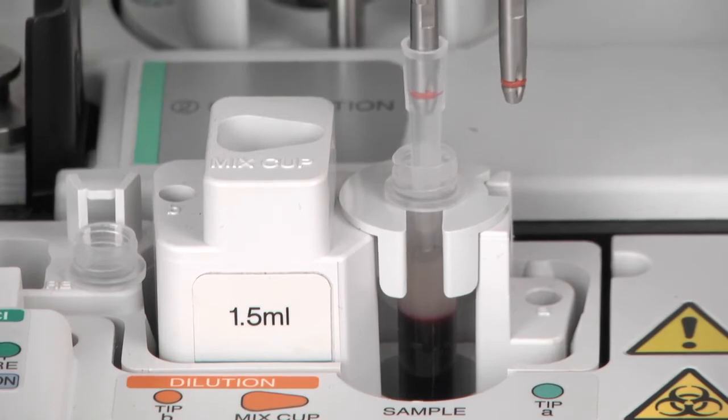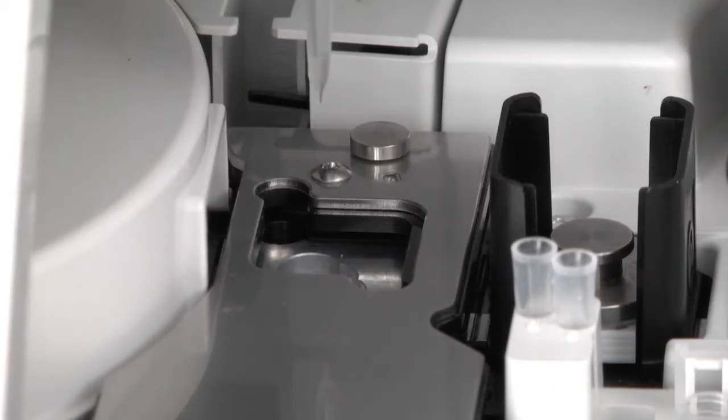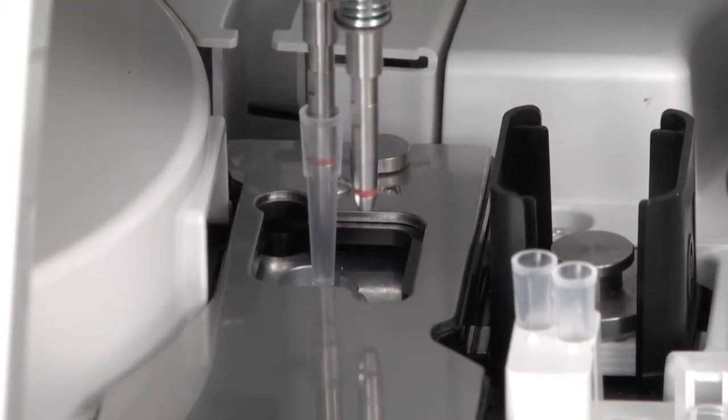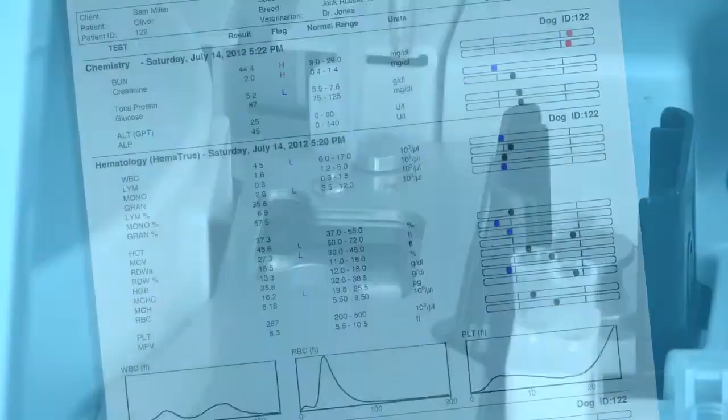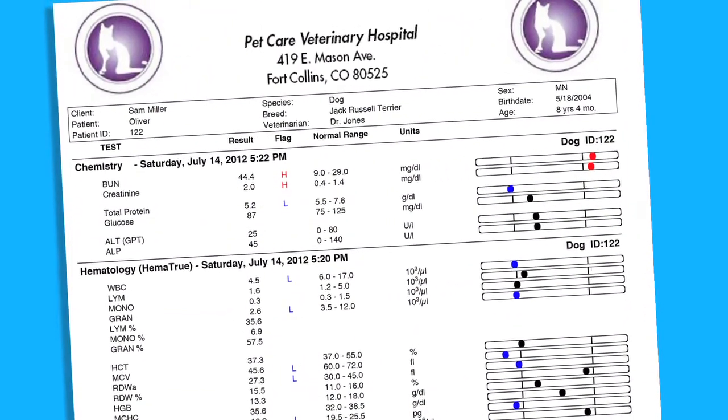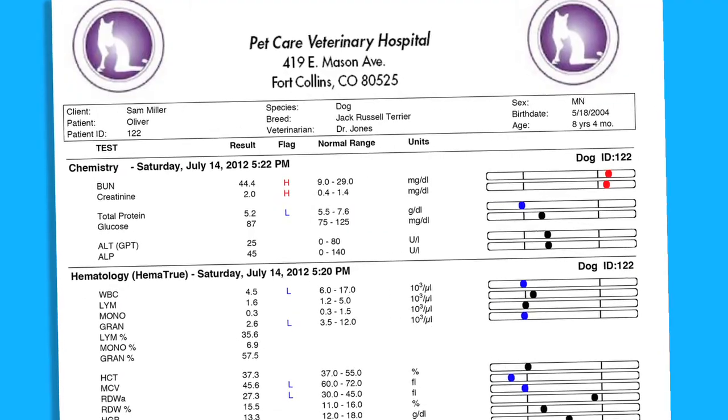You can run any combination of up to 22 tests at a time in one sample run with just 1.5 milliliters of sample, and results will be combined into one easy-to-read report using Heska's integrated software.